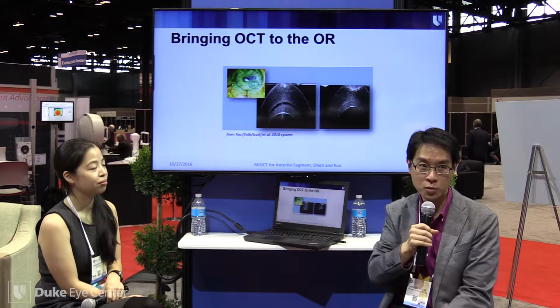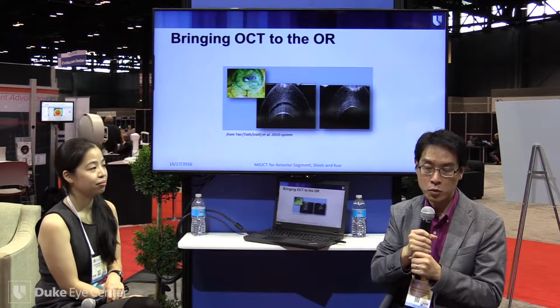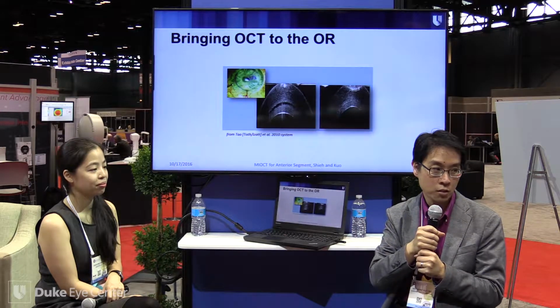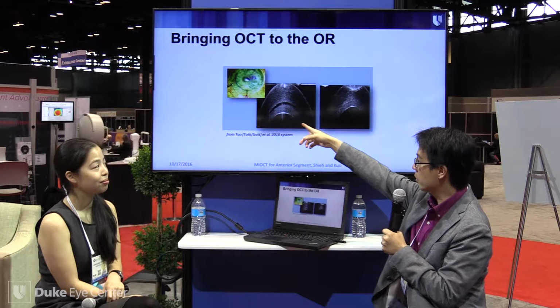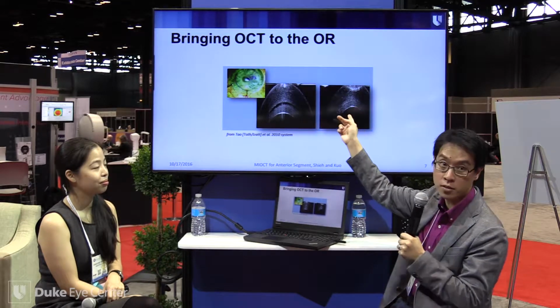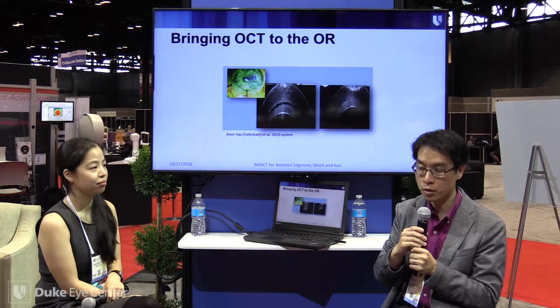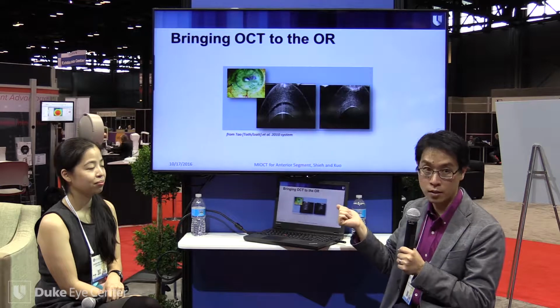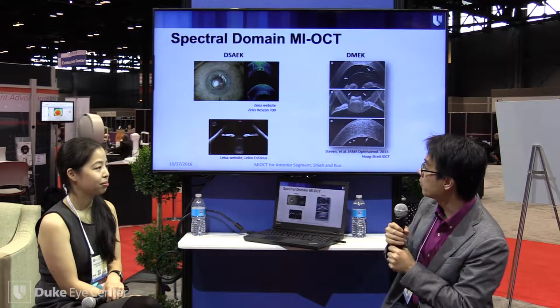That space in between is bad, because that means these two won't work together as a single cornea. And we want to identify that before you see them post-op the next day and realize these two things aren't attached. So if you can, in the OR, tell there's a space here, there's no space, this is good to go, this helps us so that you don't have complications afterwards post-operatively. So this is an advance, we feel, in visualization to match those advances in surgical technique that Christine was talking about.